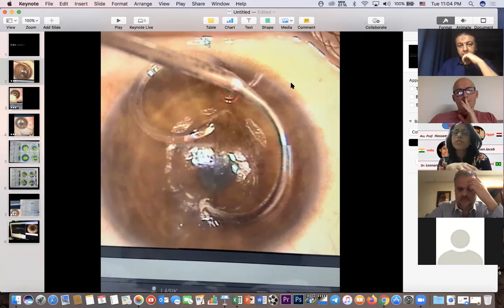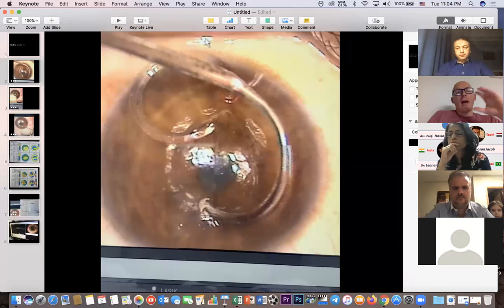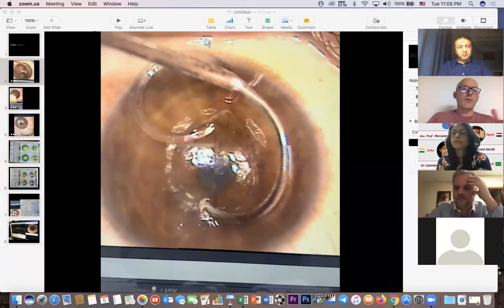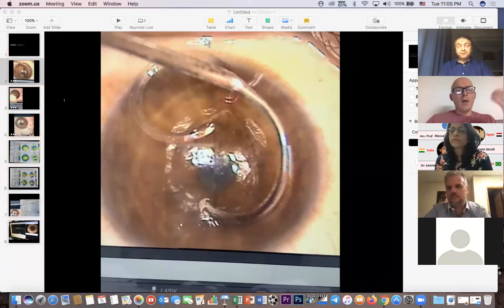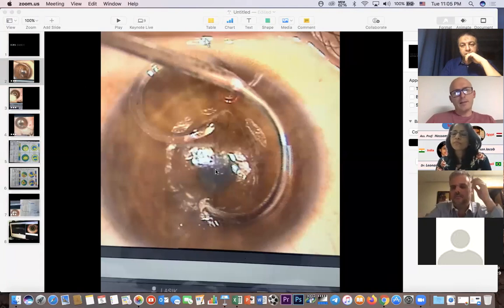It is just both eyes of the same patient, similar keratoconic pictures, but the difference was seen between the post cross-linked cornea and the pre cross-linked cornea. Now, Leonardo, what would you say about that? Well, as cross-linking acts in the anterior two-thirds of the cornea and the ring is deeply implanted, I don't think there is any problem in implanting rings after cross-linking. However, as the cornea is stiffer, we may expect less result than in a virgin cornea, but you can do it. You still do get results, but probably not as much as in a non-cross-linked patient. Exactly. Yes. Okay. Dr. Rifai?